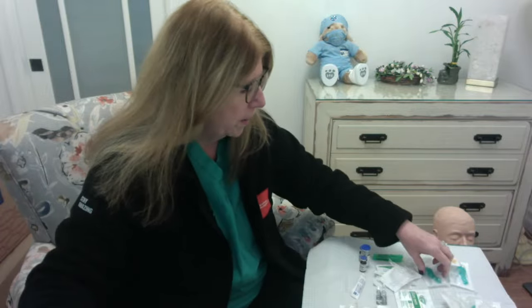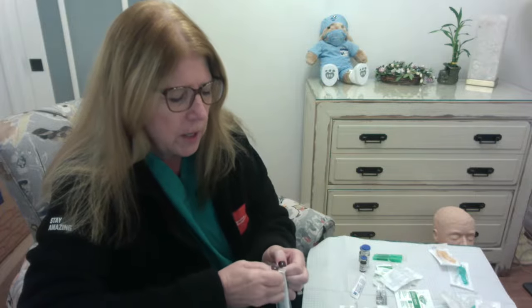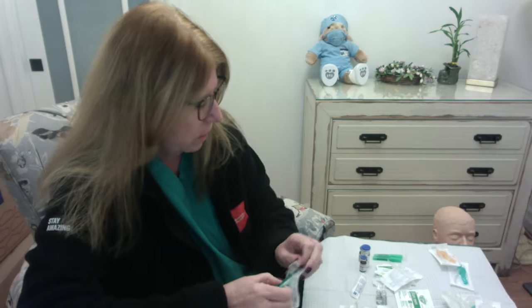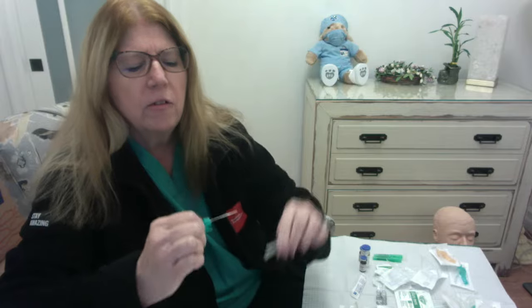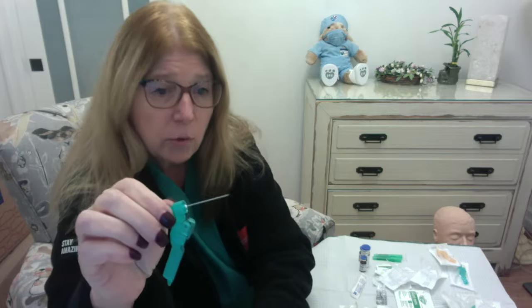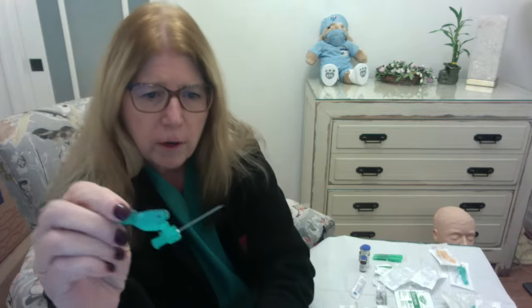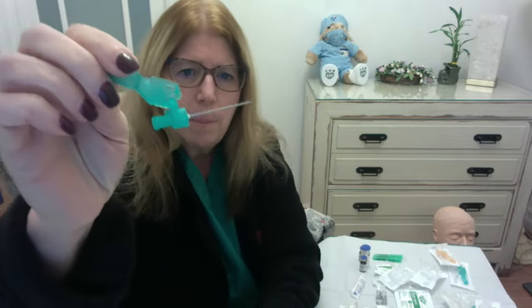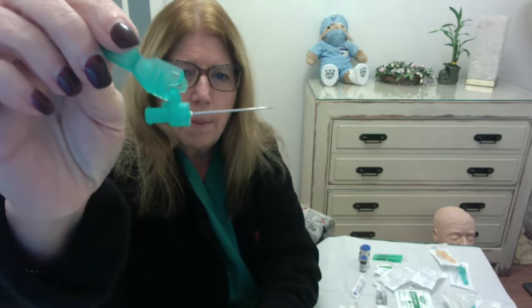Let me just open another one because I want to try to show you the needle in and of itself by taking it out of its covering. Okay, so if I just take this needle out, now I couldn't use this needle, because I've put my fingers on the hub, but I'm just trying to show you, I'm hoping that you can see that the tip of that needle comes to a sharp point.